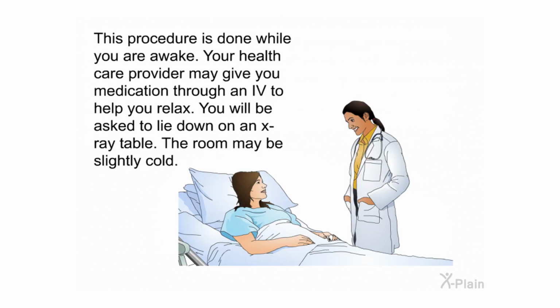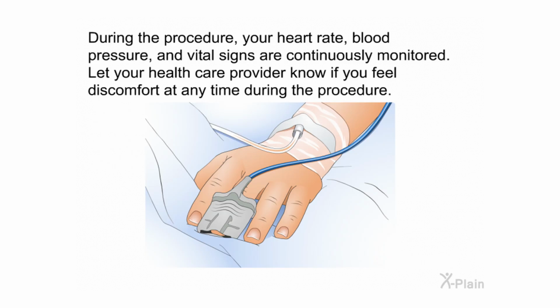This procedure is done while you are awake. Your healthcare provider may give you medication through an IV to help you relax. You will be asked to lie down on an X-ray table. The room may be slightly cold. During the procedure, your heart rate, blood pressure, and vital signs are continuously monitored. Let your healthcare provider know if you feel discomfort at any time during the procedure.